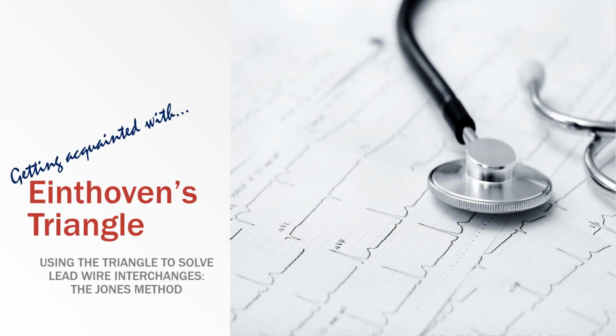Hello, welcome to Getting Acquainted with Einthoven's Triangle, using the triangle to solve lead wire interchanges.